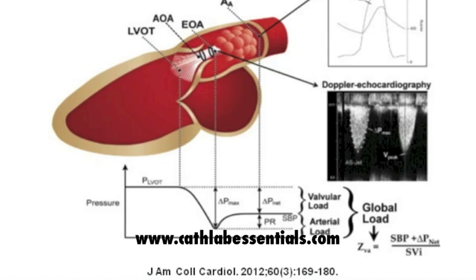The highest velocity is measured at the effective orifice area, producing a slightly higher pressure at times than the aortic catheter-based measurements, and aortic catheterization hemodynamics do not always account for pressure recovery. So slight differences between these two characteristics should be recalled when assessing the aortic valve.